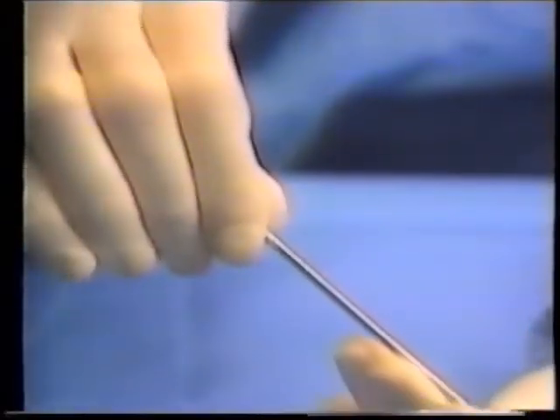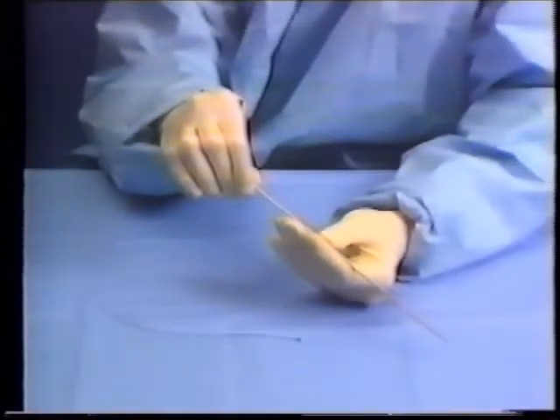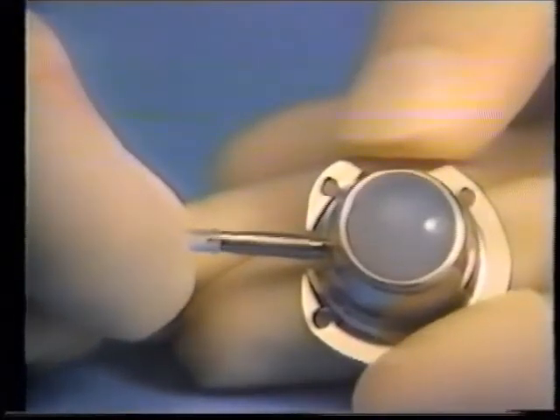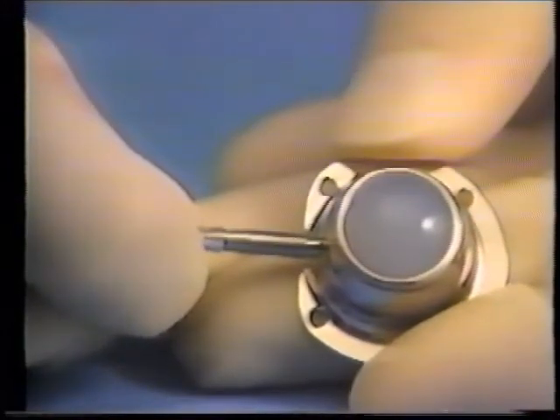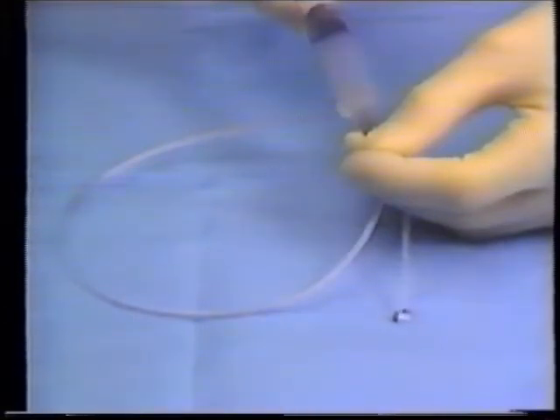Another advantage of the Groshong port system is the insertion technique. Its advantages are the unique tunneling trocar, which simplifies tunnel creation and reduces tissue trauma; the post-attached connection system, which eases insertion; and the flush-through stylet, which allows fast, easy use.